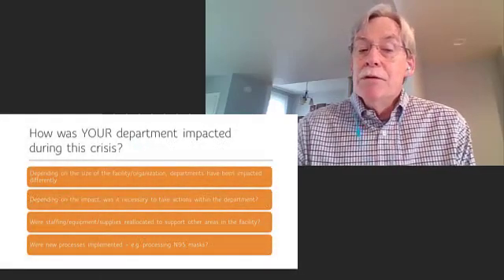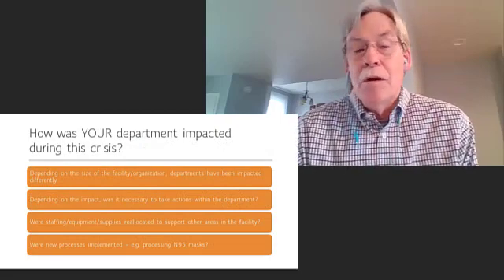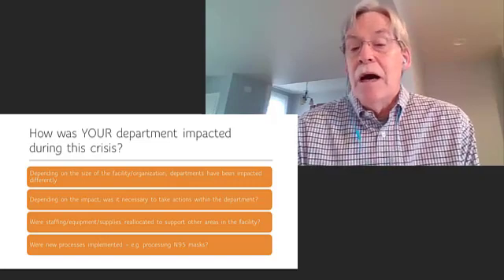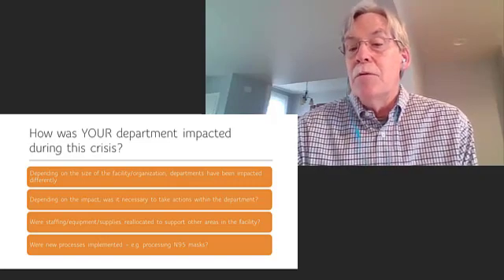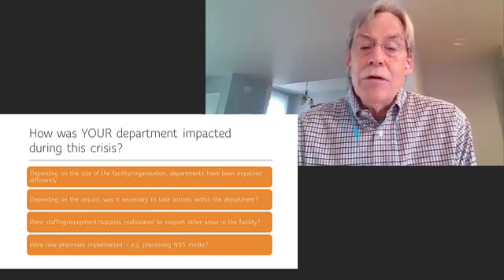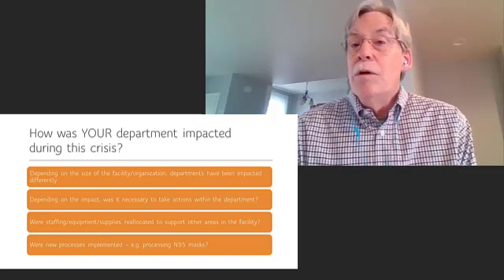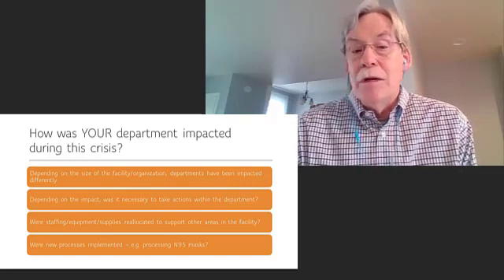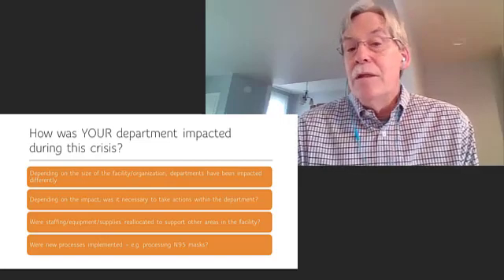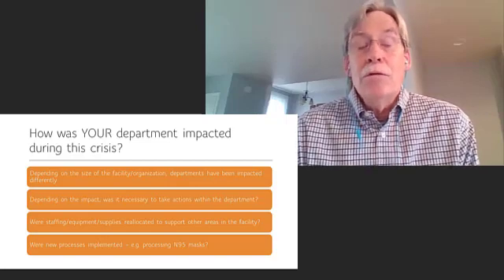So we've seen multiple versions of how processing sites have been affected, both short-term and long-term. Many ambulatory surgery and endoscopy centers are closed. Hospitals are seriously limiting the number of procedures and surgeries being performed. So depending on the extent of the shutdown, conversations and questions began pretty early on. What do we do with processing equipment that would be sitting idle? What do we do with processing chemistries? What, if anything, different do we need to do with endoscopes? And what, if any, work was left for staff?